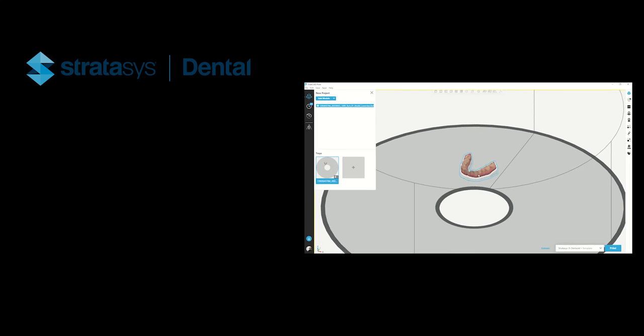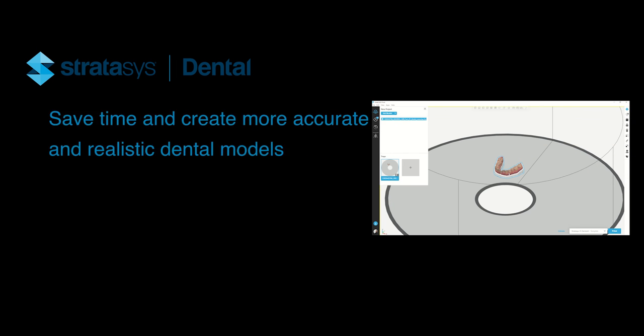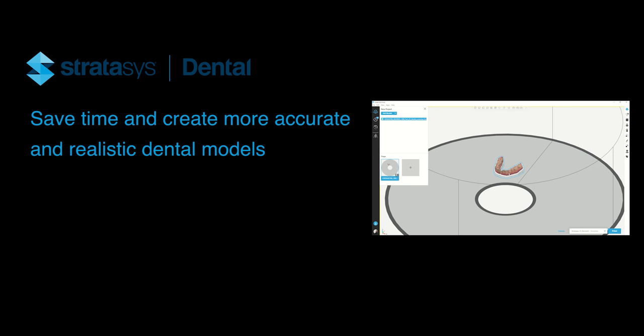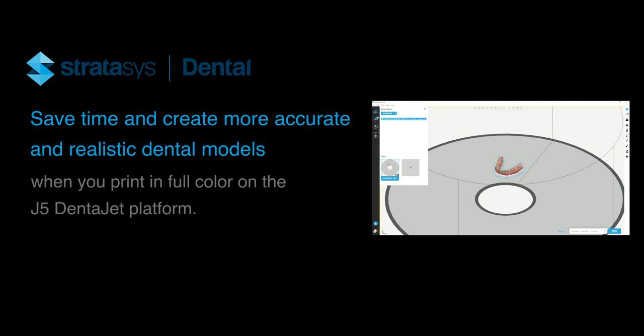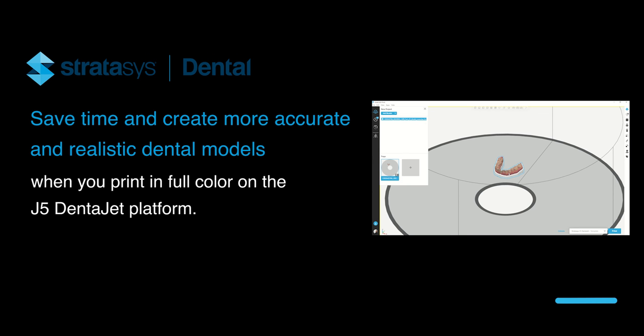Now you can save time and create more accurate and realistic dental models when you print in full color on the J5 DentaJet platform.